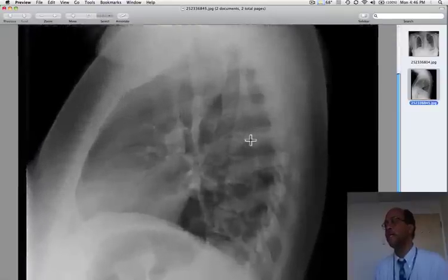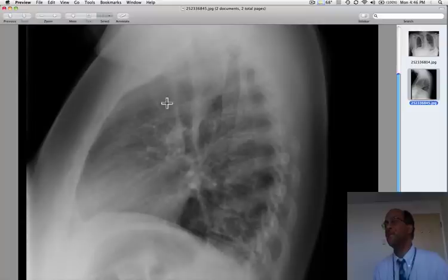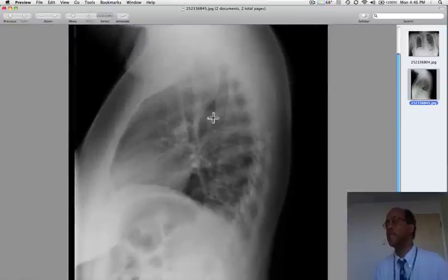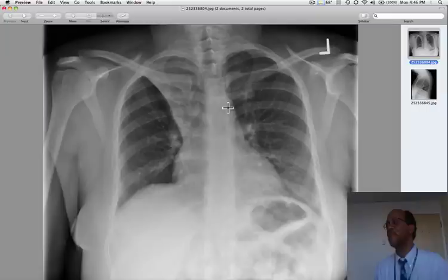On the lateral view, we can see this minor-looking opacity that you have to keep your eyes peeled for. All of this is the collapsed right upper lobe. In the context of a patient with asthma, we can presuppose that this is a patient with a mucus plug, and that this should respond to pulmonary toilet and chest physical therapy.